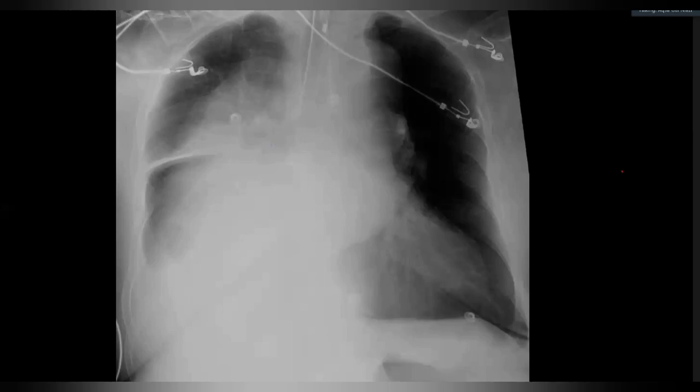Sir, I would like to take any history of any trauma of this patient. Okay, so no history of trauma. Good question. No history of trauma. Or sir, any previous comparison with any previous imaging study? Okay, all right.